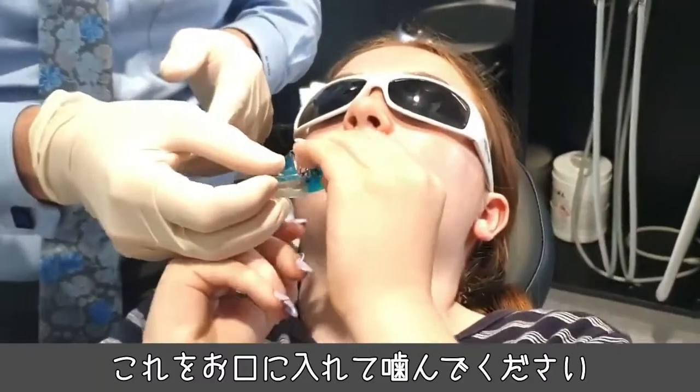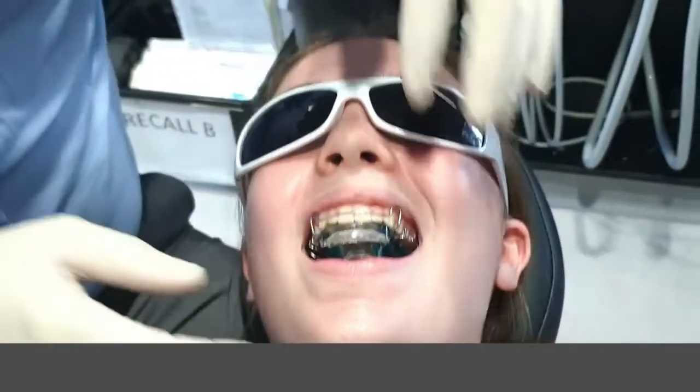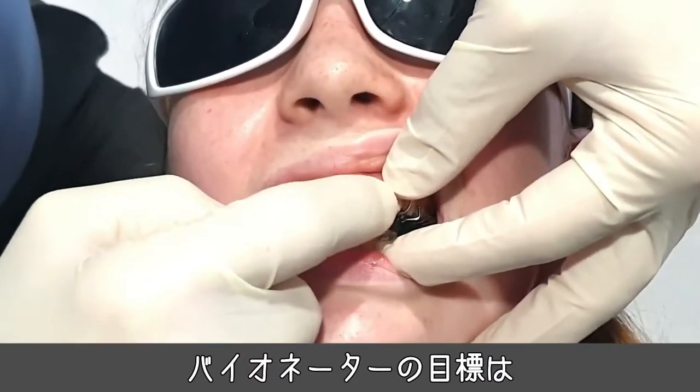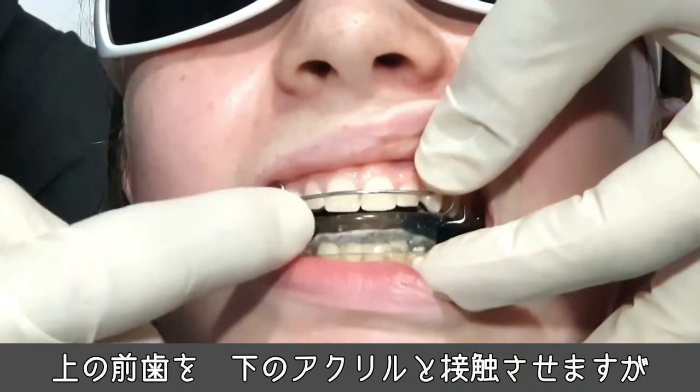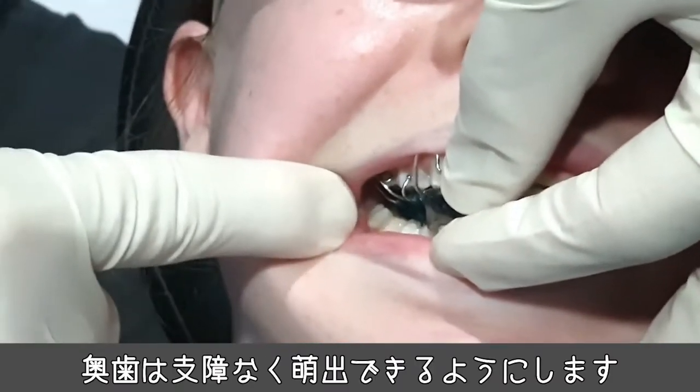Can I get you to put that in? Great, perfect. Bite together. So you can see the goal with the bionator — the upper teeth should be in contact with the lower acrylic, just like that, but the posterior teeth are free to erupt.